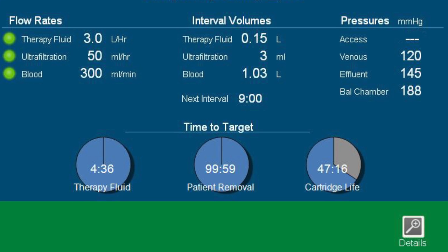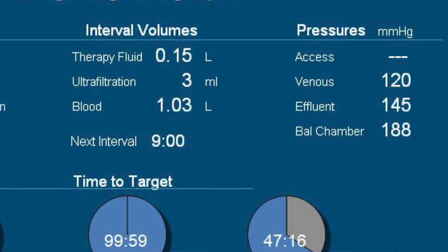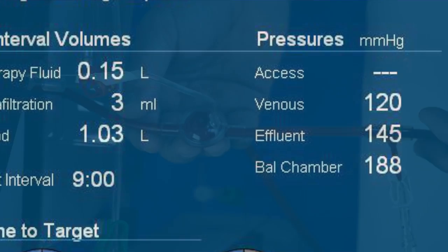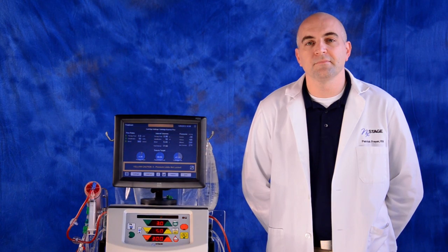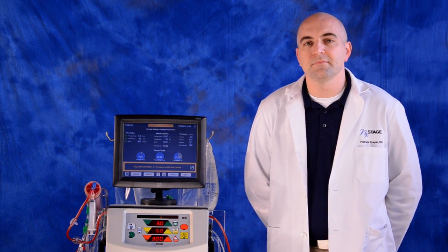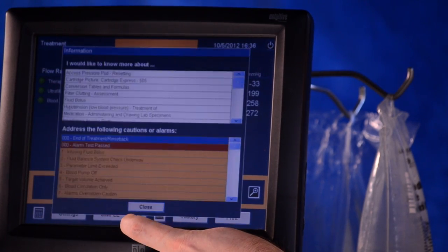This action may also be indicated if the machine is no longer displaying an access pressure, if the pressure pod is no longer pulsing, or if there is little to no fluctuation of the access pressure over time. The procedure for resetting the access pressure pod can be found on one view under the FYI or Information tab.